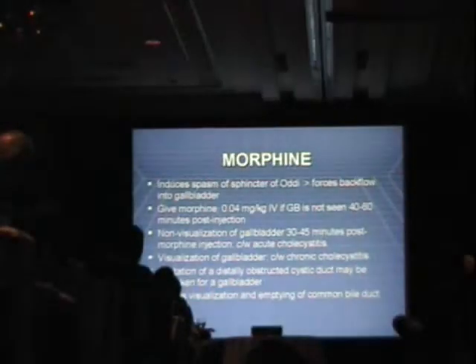So here's a normal HIDA scan. Liver comes up first, maxes out very early. See the intrahepatic duct, cystic duct, now gallbladder, now common bile duct, and lastly, the bowel. Now you see how in the center, in the portal area of the liver, in this anterior view, a lot of these structures sort of overlap. The cystic duct and the gallbladder can be hard to differentiate. And I'll show you another case later on that will explain the importance of that.